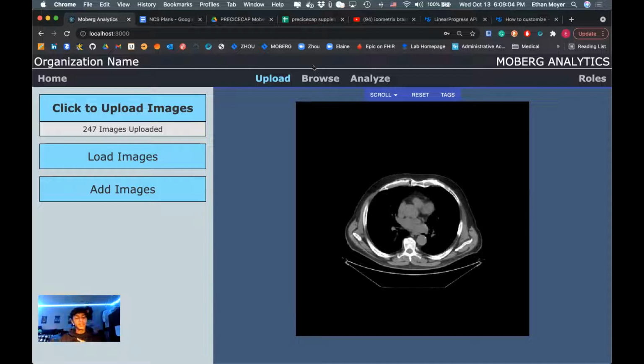Ethan, so these slices are coming from top to bottom. Yeah. Right. So it's not about taking the largest one. It's about taking the one where you see cancer. Okay. Yeah. So maybe it's the selection, right? So one where the cancer is seen in the image, we take that slice. Okay. So then we'll have to identify that one.